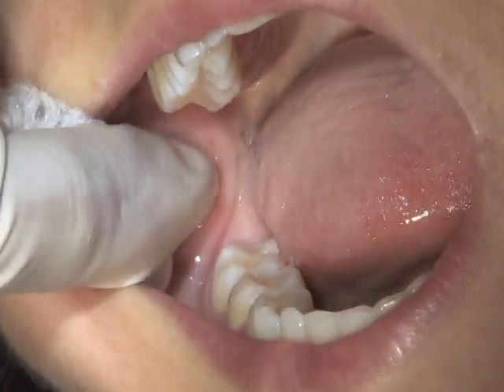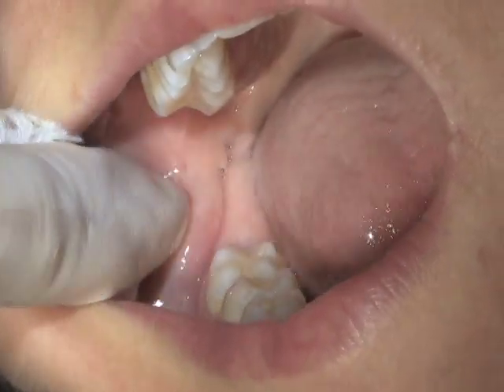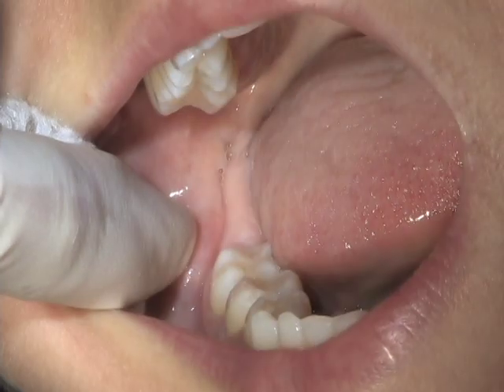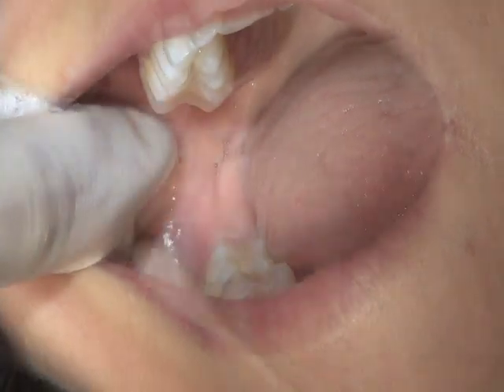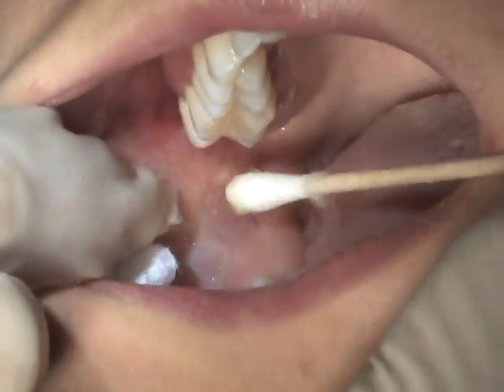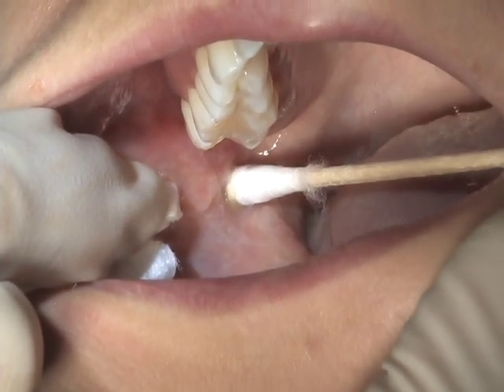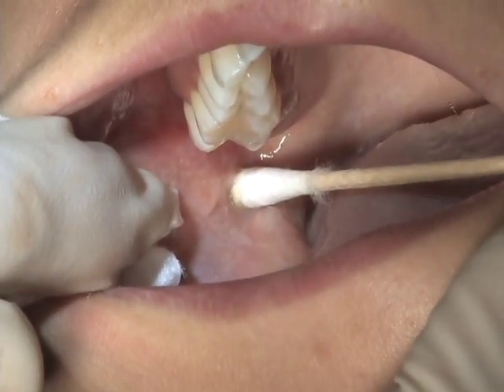Gently retract the cheek laterally. Locate and palpate the internal and external oblique ridges, coronoid notch, and pterygomandibular raphae. Dry the tissue with a two-by-two prior to placing the topical. Place topical in the pterygomandibular triangle, which is the depression created by these landmarks.